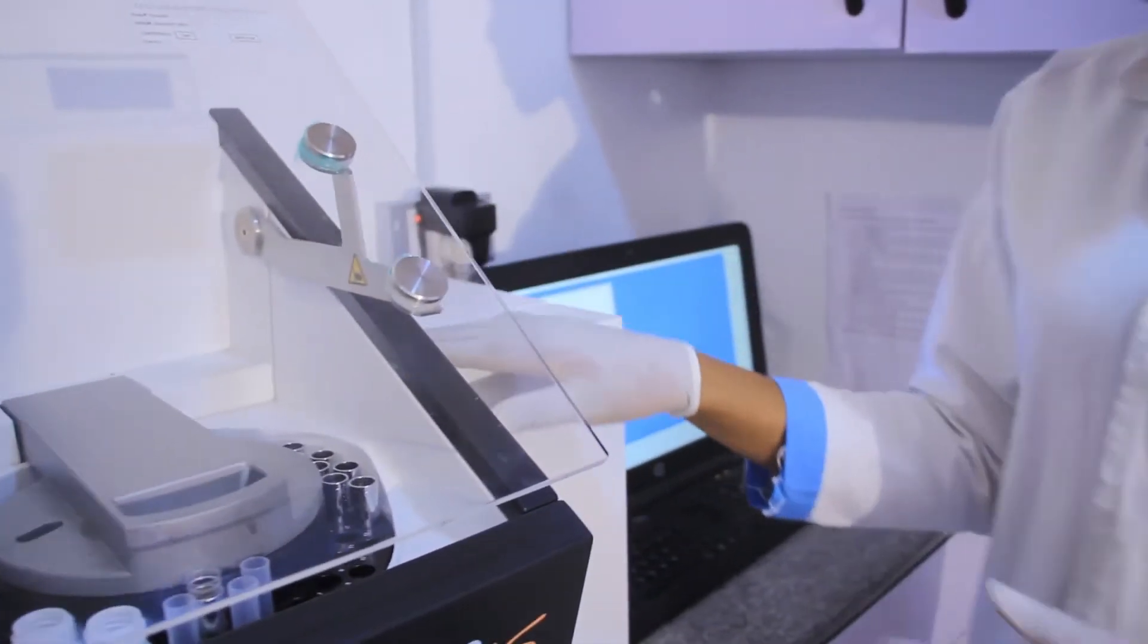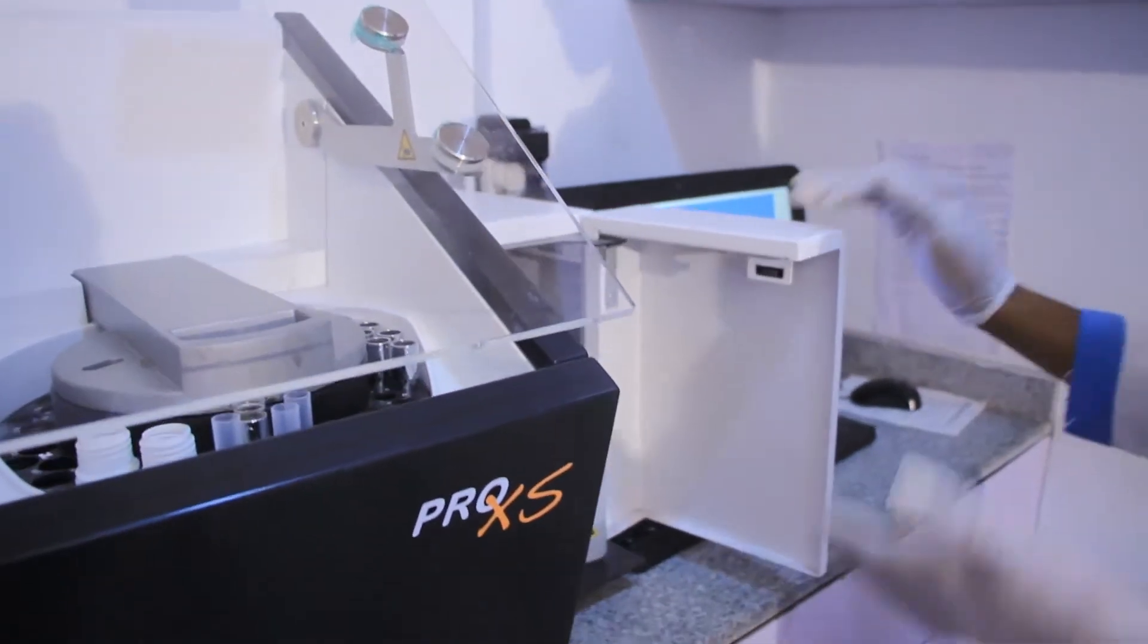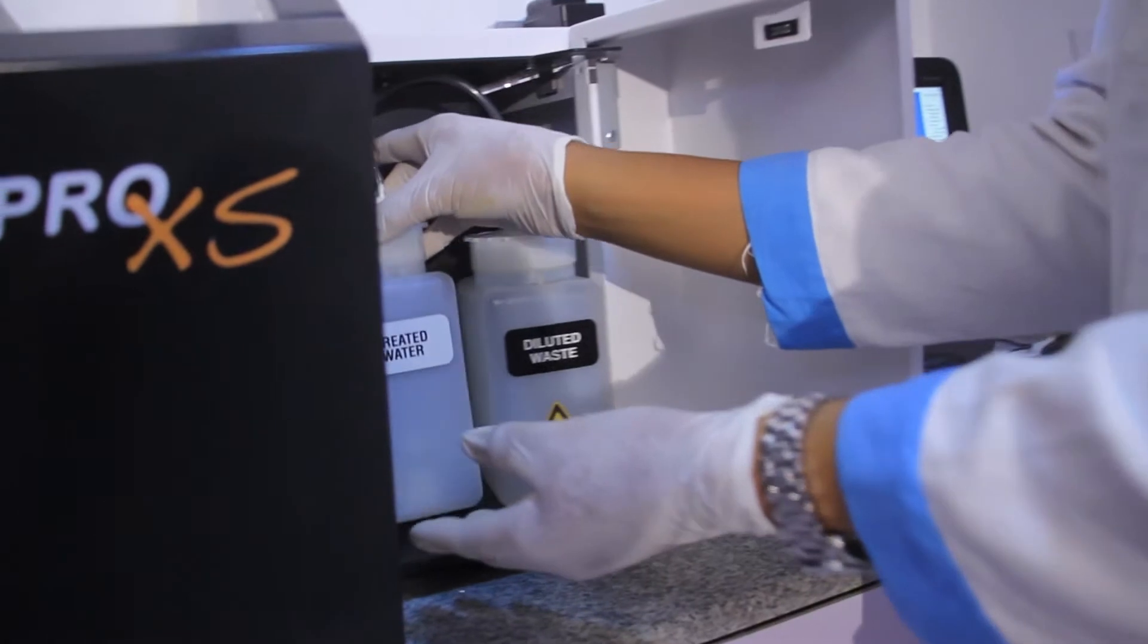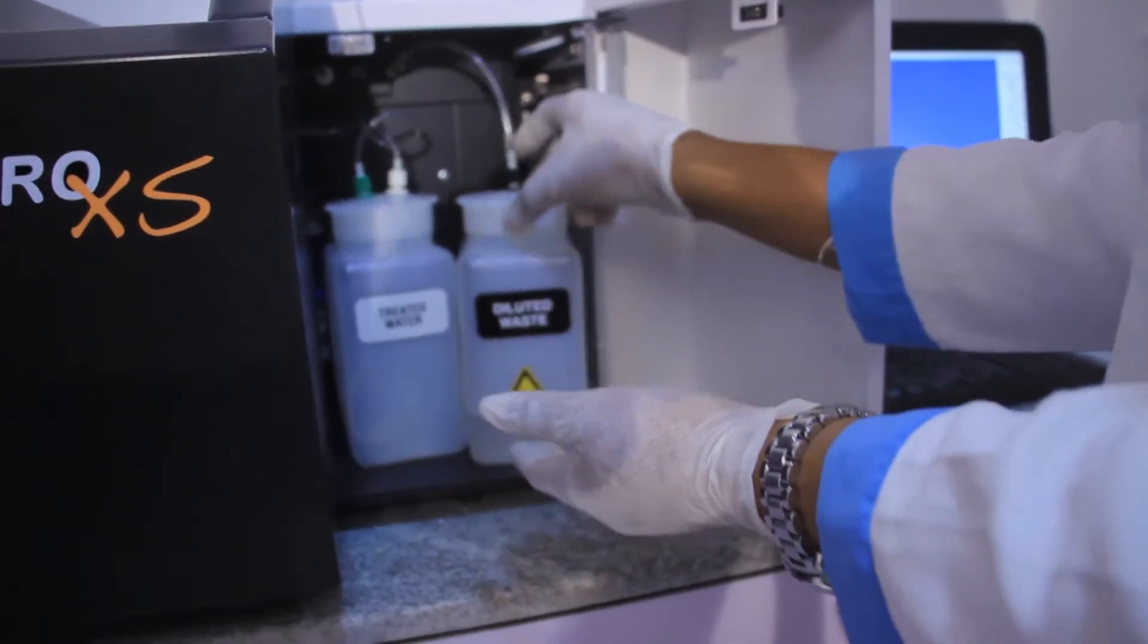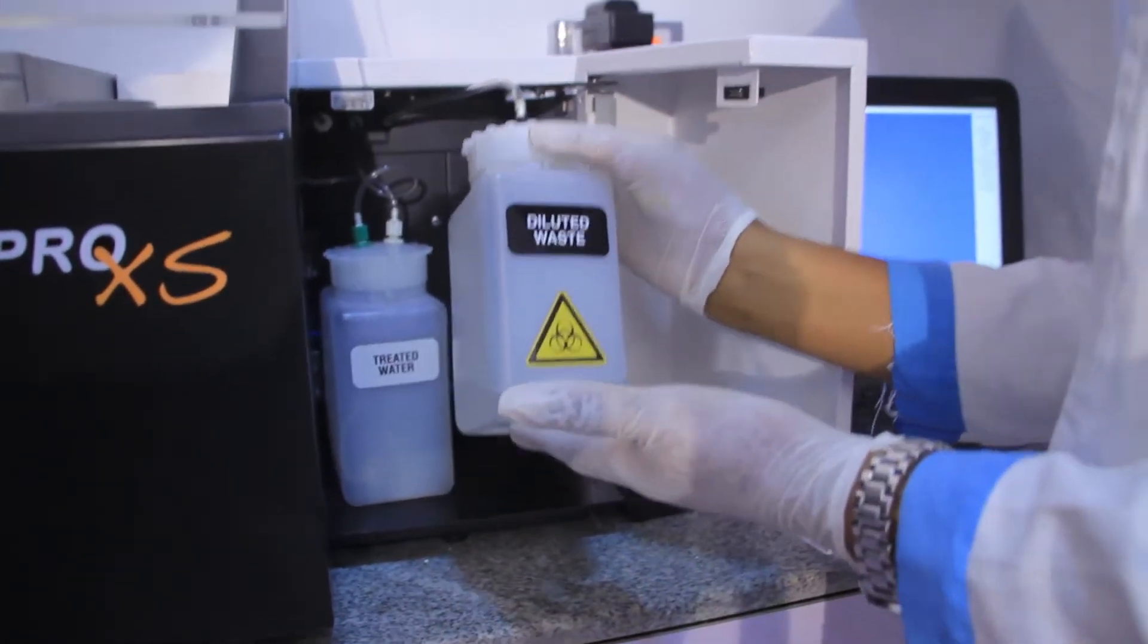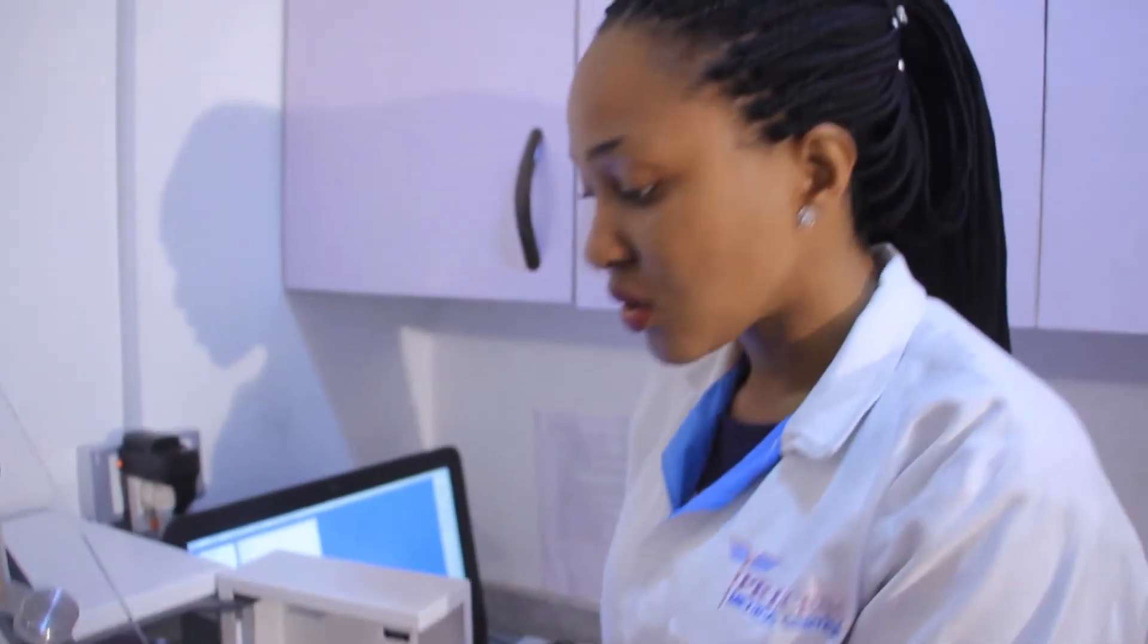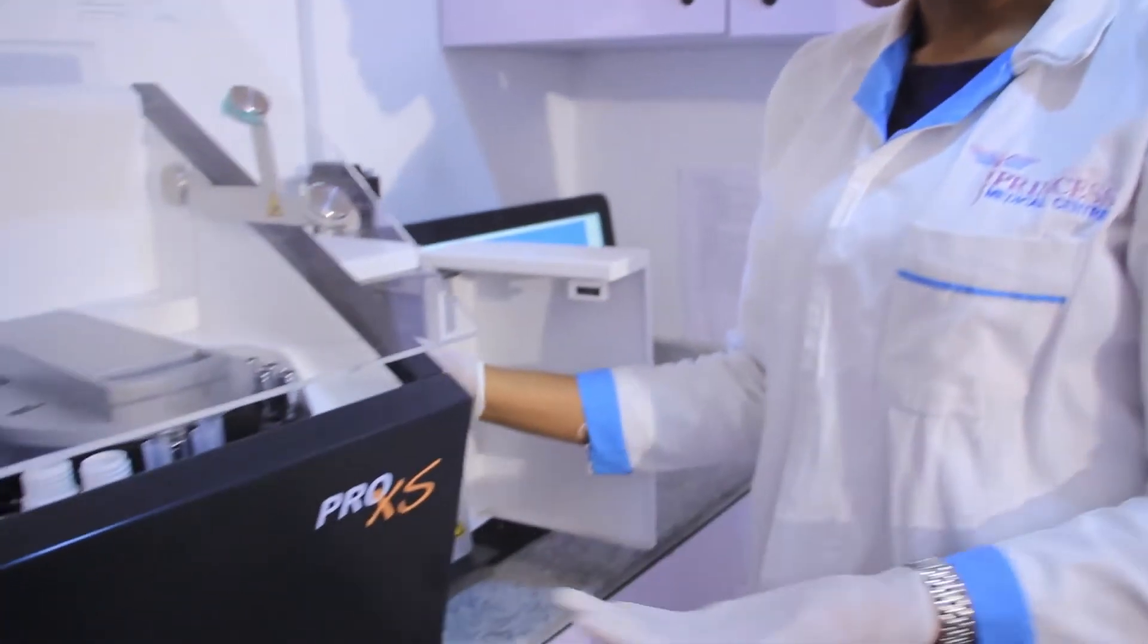Over here on my right, we have the water compartment. The water compartment is made up of the treated water and the diluted waste. The diluted waste is where the analyzer deposits its waste, while the treated water is where the analyzer picks up treated water and runs the samples.